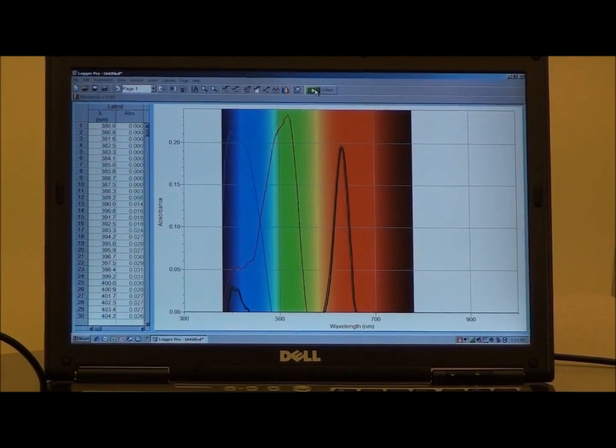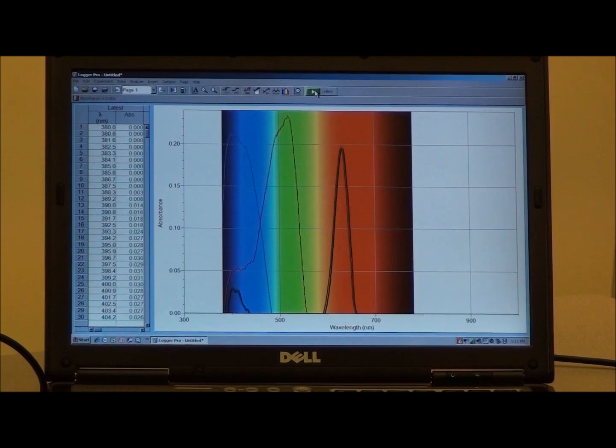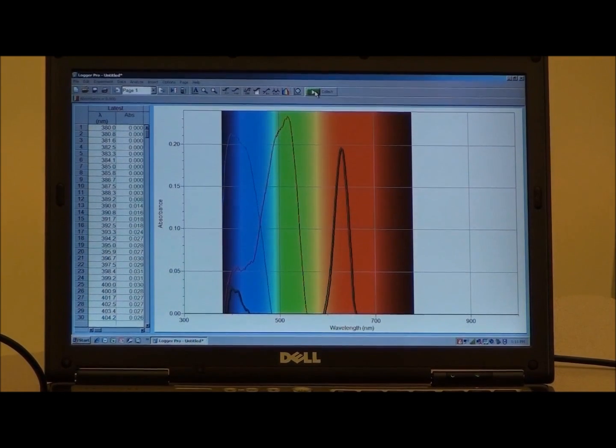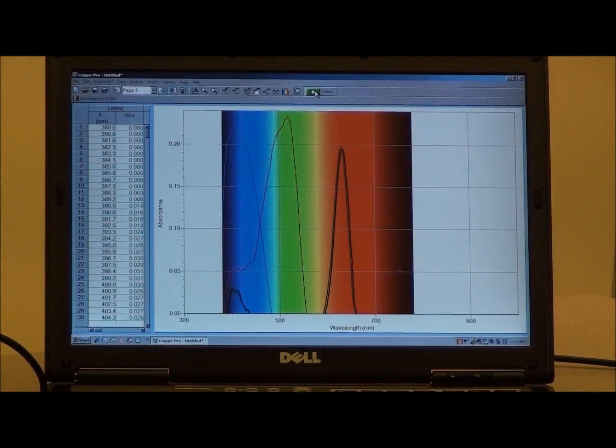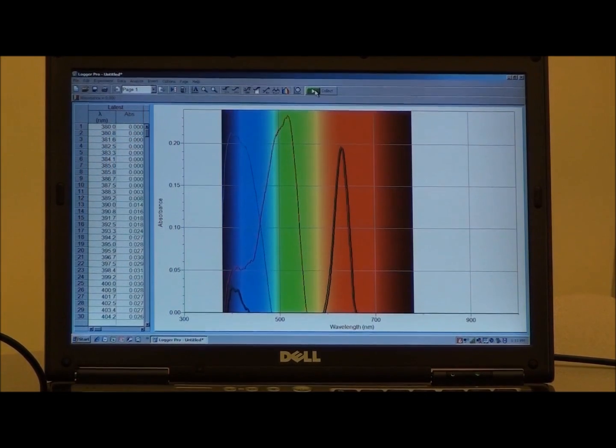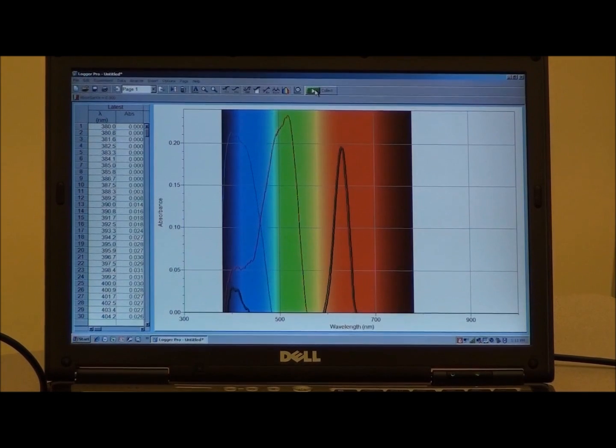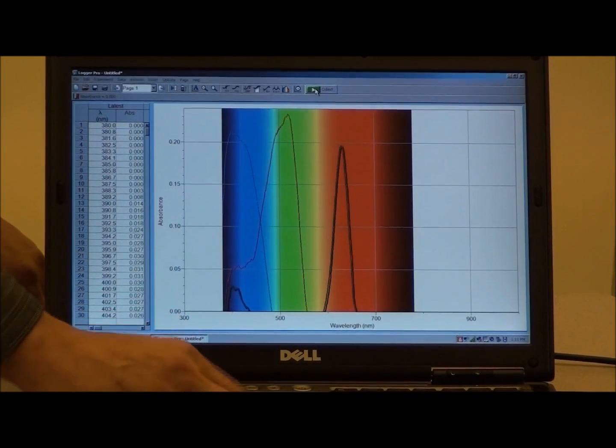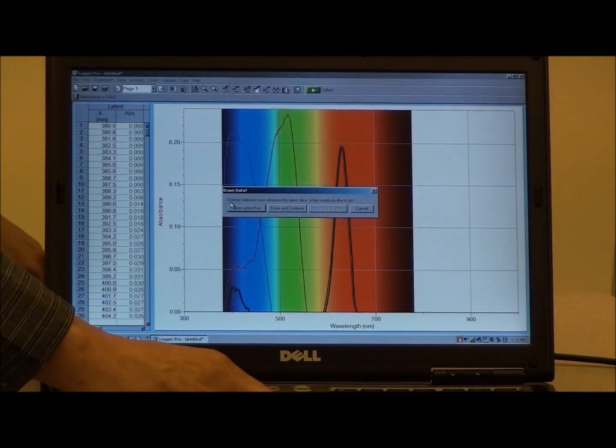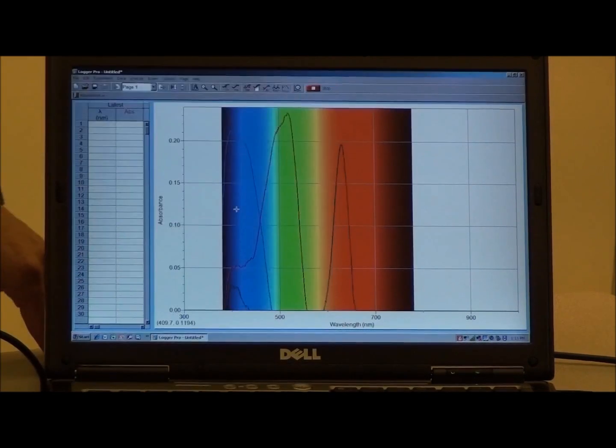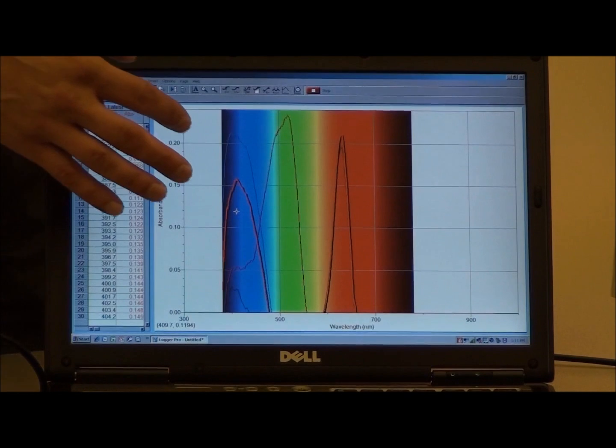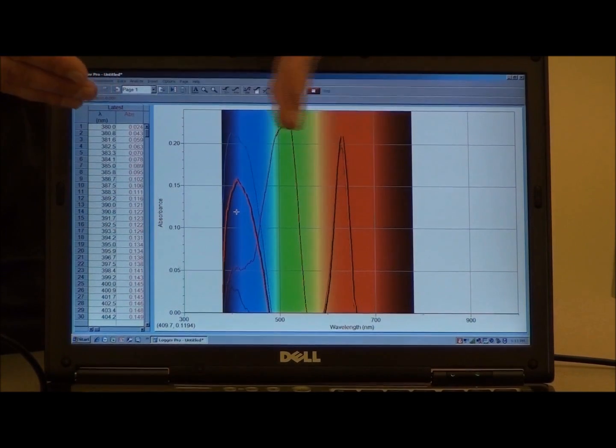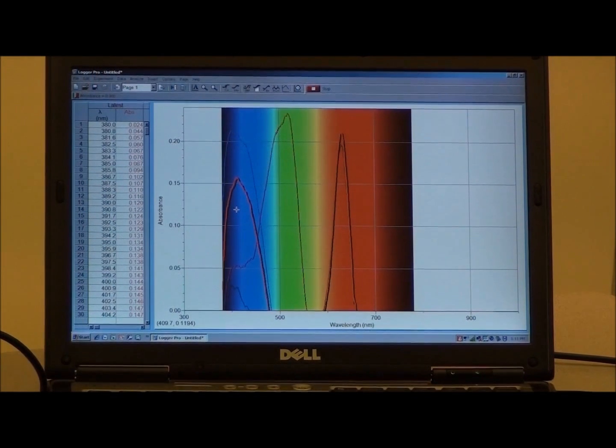What if we had a solution that was green, which of course is a mixture of yellow and blue? Let's take a look at this green solution. Once again, we'll keep the old data on the display. We can immediately see that this solution has two components as expected. One component is yellow and the other component is blue.